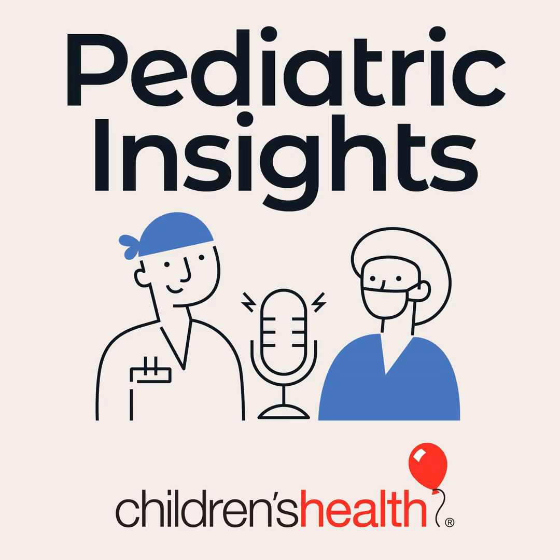We wouldn't really be offering this in the first trimester or really the early second trimester, but mostly targeted to the third trimester. And when you look at the studies on fetal MR, just for the body, there's been safety shown when it's done in a skilled way.